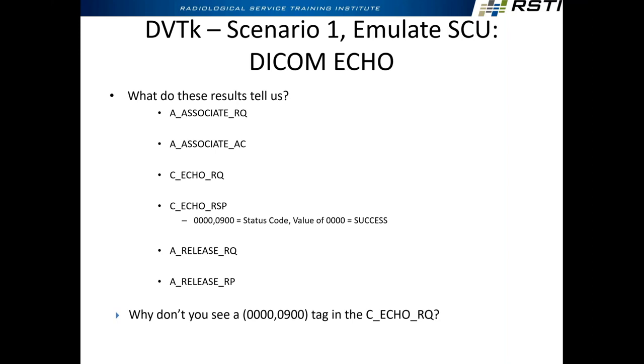And you have varying access to logs. Every system does this, but you don't see it because you have varying access to logs. Your PACS administrator should have access to logs like this. They probably don't know how to read them, is the truth of it. But there are some kind of logs that break down like this.